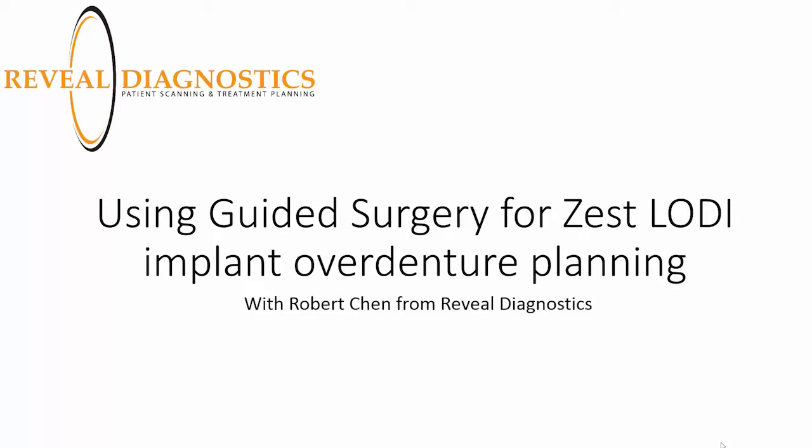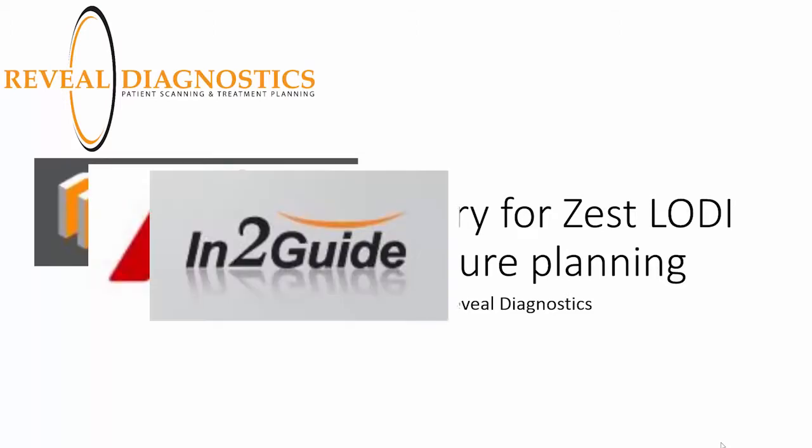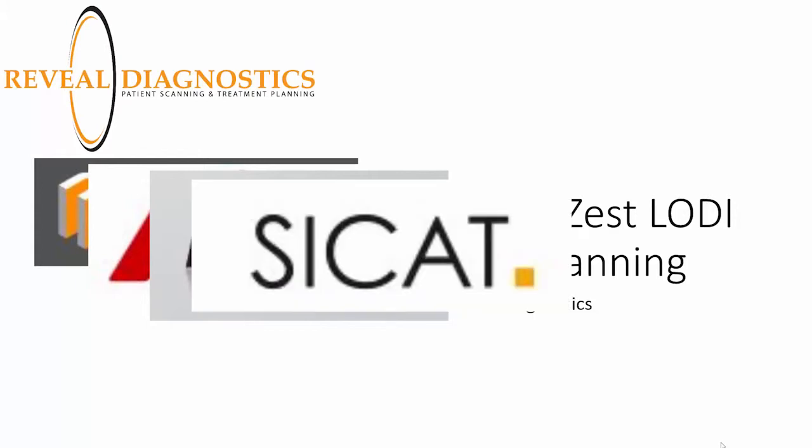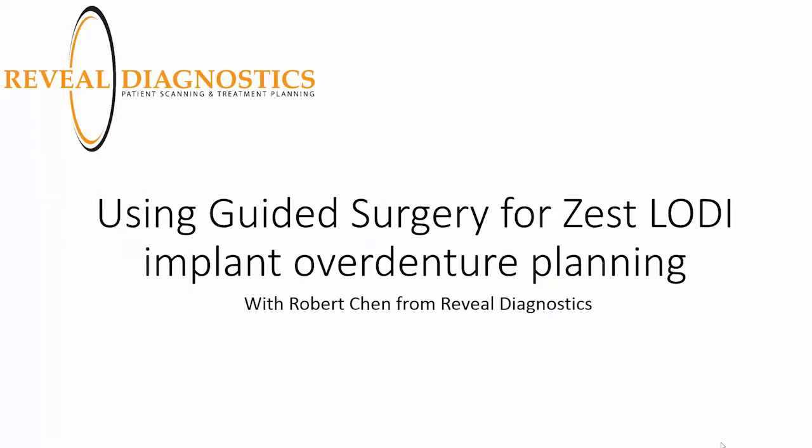There are a number of companies that will make CT guided stents for you, and many of them are excellent. Each system is different, and no single system is the best at everything and for every application. Regardless of which company you choose to partner with, it is important to fully understand the scanning requirements of your system before you begin. This will keep the process moving forward efficiently and also prevent having to expose your patients for multiple CT scans.